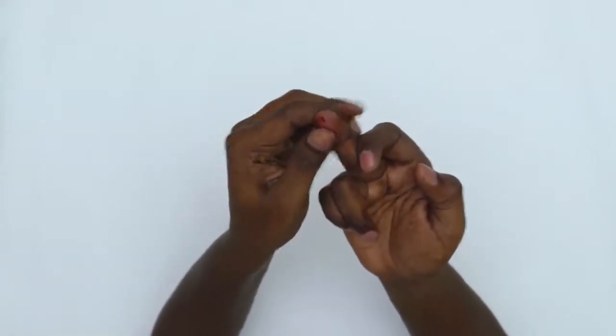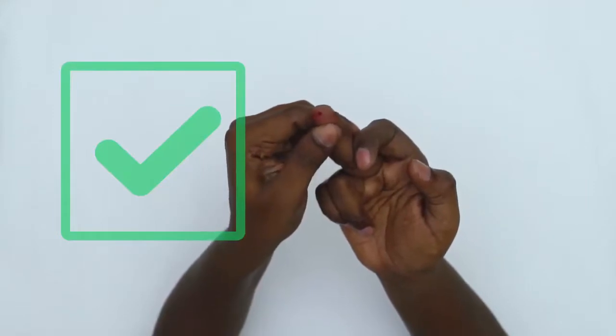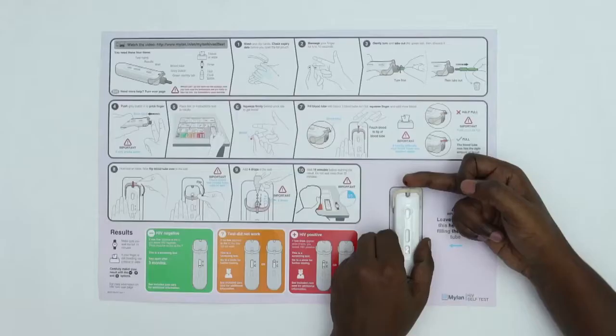Make sure you firmly squeeze your finger behind the prick site to get more blood and touch the blood to the tip of the tube. It is important that the tube is full — repeat until it is full. This will ensure the test has the correct amount of blood.